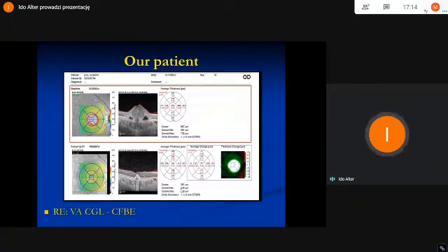So let's go back to our patient. In the day after his admission to ER, he was treated with a single intraocular injection of Avastin. As you can see in the OCT 1 month later, the central macular thickness is 293 micron compared to 670 during his admission. There is shrinkage in the hyperreflective lesion and disappearance of intraretinal cyst and subretinal fluid.